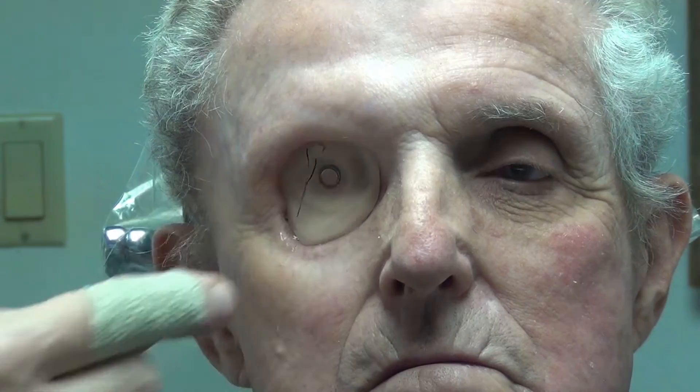we were able to essentially replicate the stability and reassuring click of the magnetic attachment without his requiring adhesive and without need of any more surgery. Our patient has since mastered the insertion of both components and reports that retention is equal to that of his previous bone anchored system.